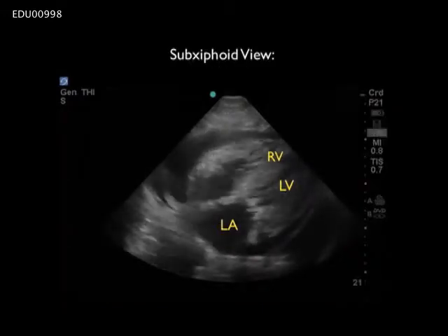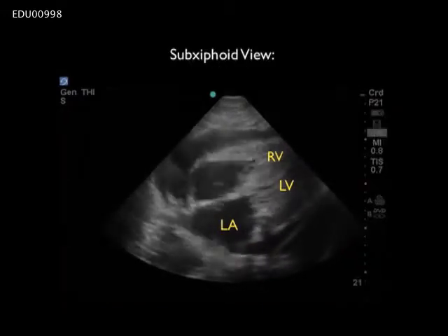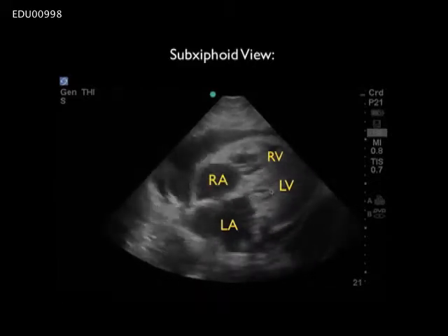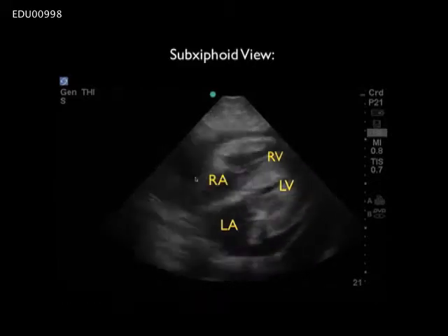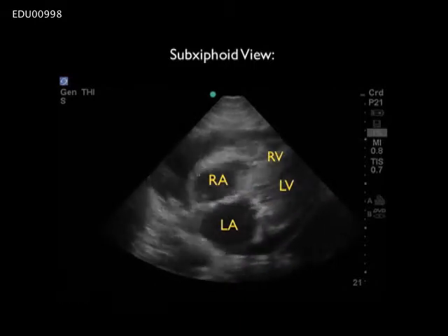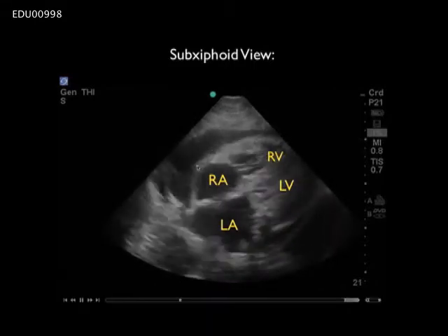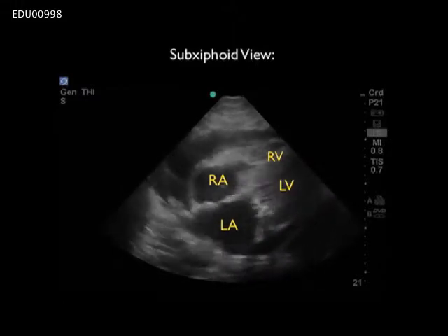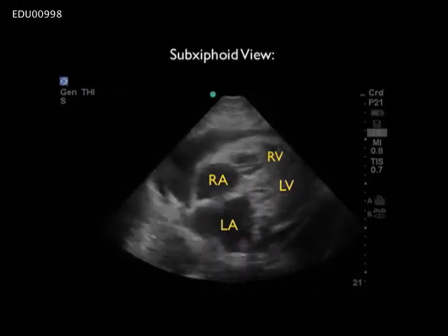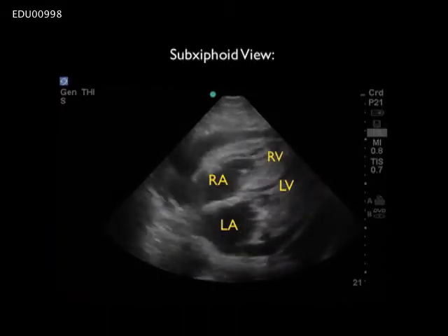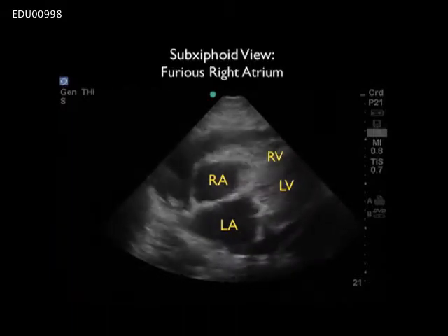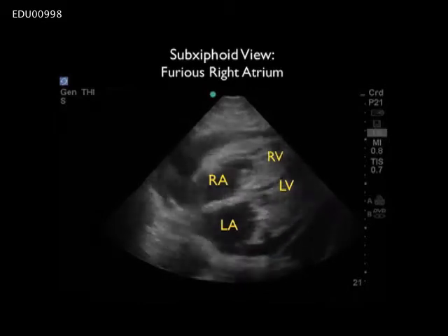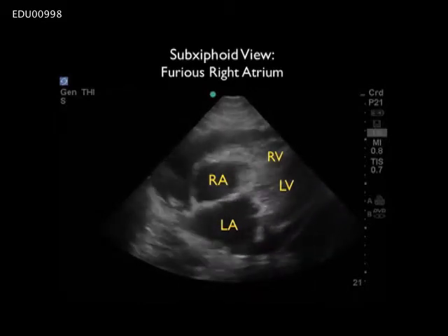Here we can see the findings of the right atrium as it attempts to compensate during early tamponade physiology. We see a furious right atrium contracting at a very high rate to push blood into the right ventricle and out the pulmonary system due to the higher pressures within the right side of the heart. I've noticed this finding quite frequently in early tamponade physiology and I categorize it as a 'furious right atrium.'